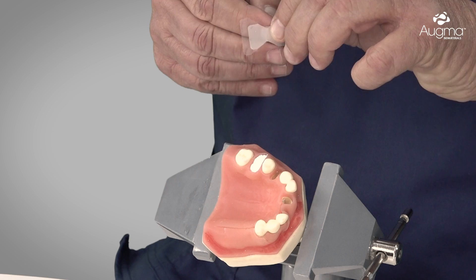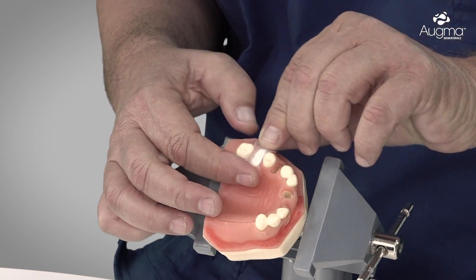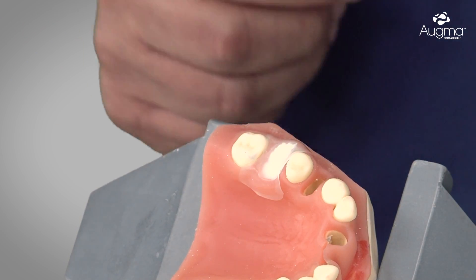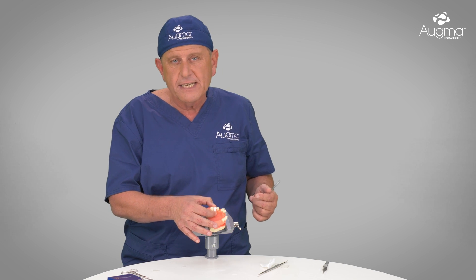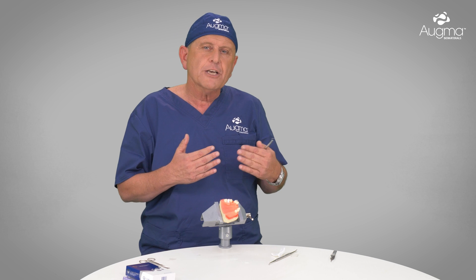Now we detach it from its underlayer and adapt it to the site. You can see that it already sticks to the soft tissue. After placing the Augma Shield, it must be secured in place until soft tissue proliferation bridges the gap. If we leave the Augma Shield without securing it by sutures, it will fall down after 5–6 hours, which is not enough. We need to keep it in place for at least 10–12 days. You can see that it has adhered to the soft tissue, and now we must secure it by sutures.